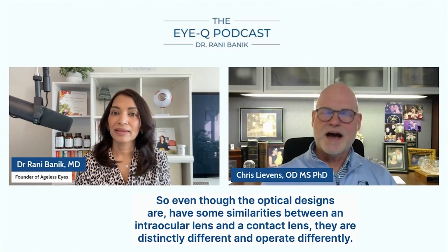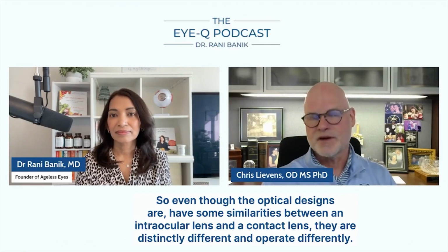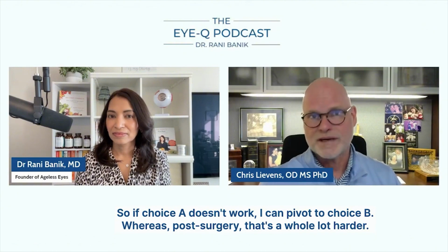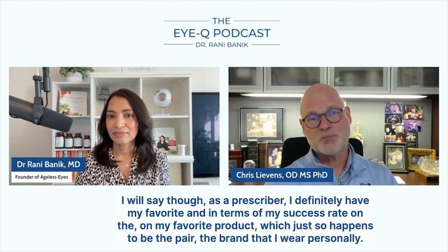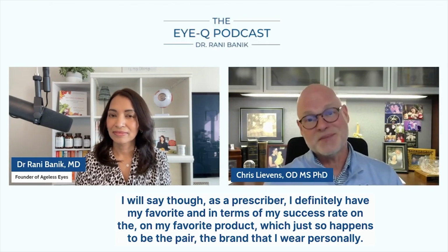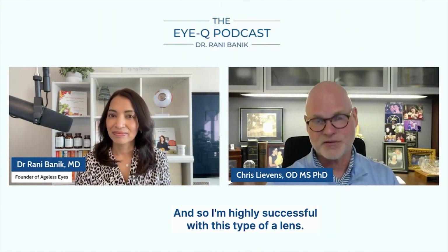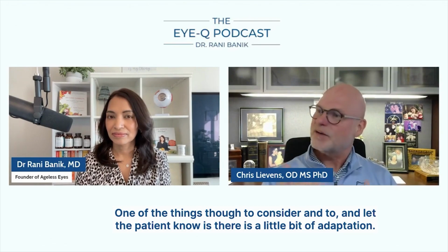So even though the optical designs have some similarities between an intraocular lens and a contact lens, they are distinctly different and operate differently. The good thing about a contact lens, unlike an IOL, is I have the opportunity to go from different optical designs. So if choice A doesn't work, I can pivot to choice B, whereas post-surgery, that's a whole lot harder to get into. I will say though, as a prescriber, I definitely have my favorite. In terms of my success rate on my favorite product, which just so happens to be the brand that I wear personally, I can only recall failing on a patient one time in my entire career. And so I'm highly successful with this type of lens. One of the things though to consider and let the patient know is there is a little bit of adaptation.